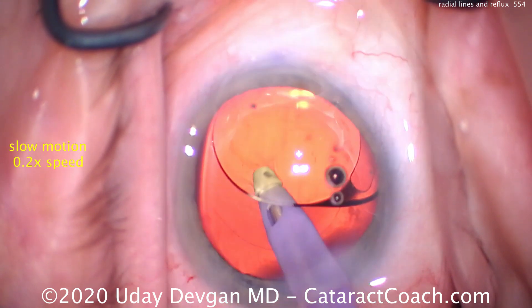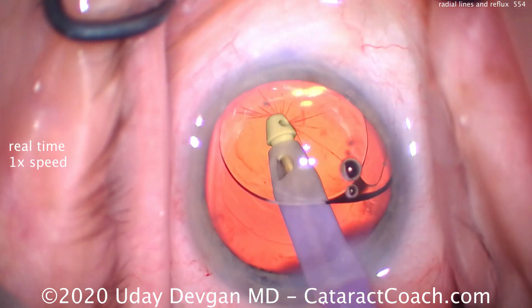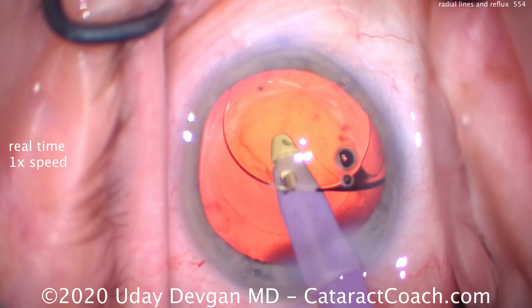We do it seamlessly — it happens very fast. Let me show you one more time in real time: there it is, and release — a little bit of reflux mode and back to regular vacuum — and continue the case.